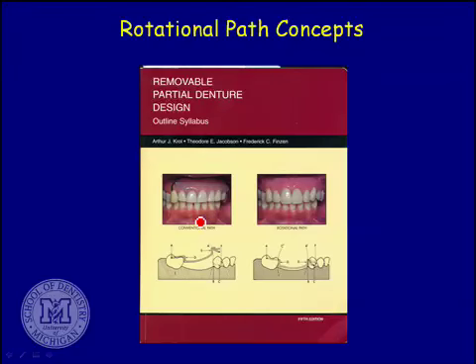Now some of you that have worked with lower partial dentures may not be aware that in these mandibular situations, the lower posterior tooth is very often tilted mesially and lingually. How many people have had one of those? Either for a crown or bridge, you've seen that lone standing molar in the back, leaning mesially a bit and lingually a bit.